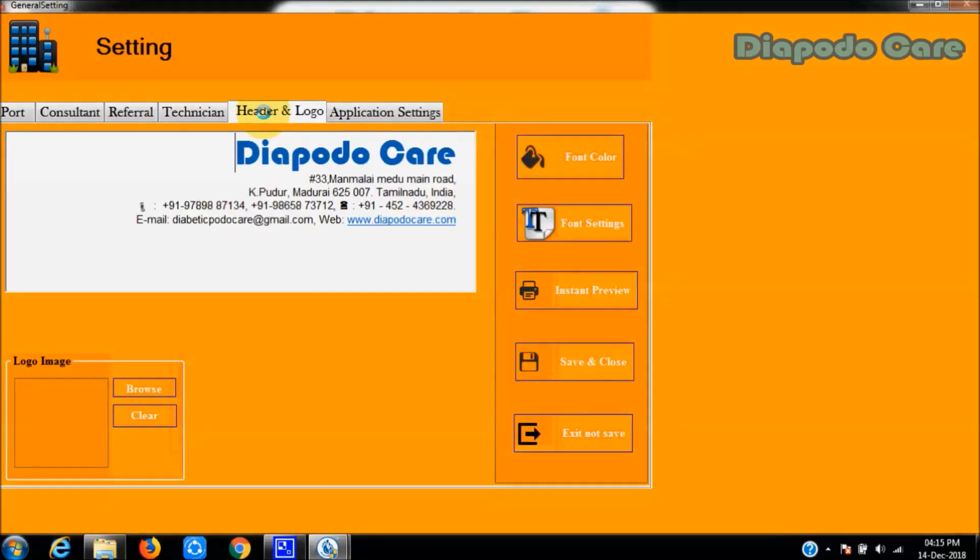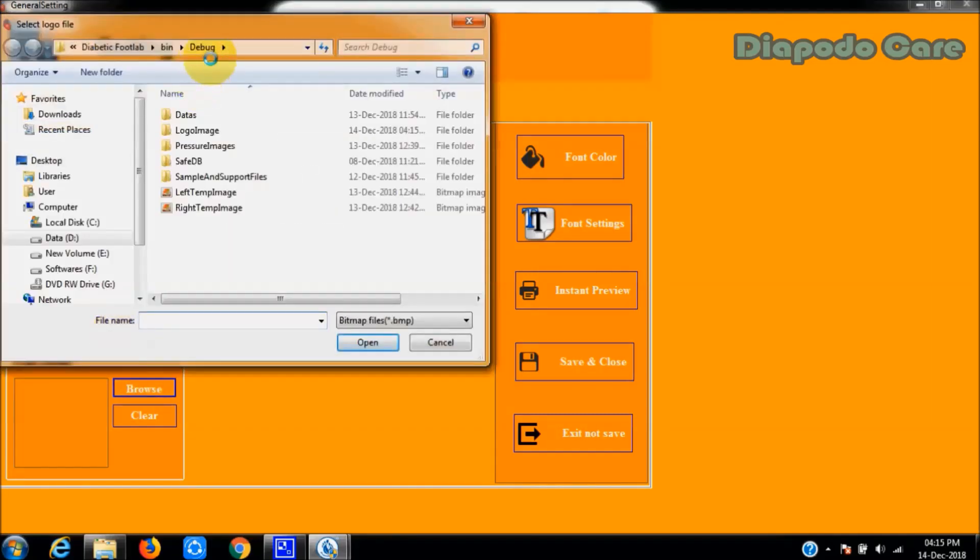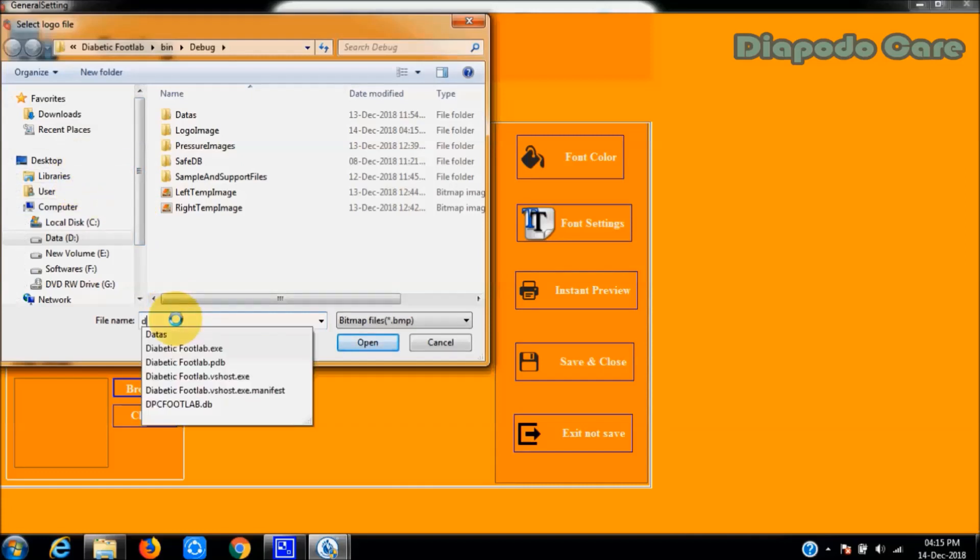Vassabi software also has an option for a customized letterhead and edit option for the patient screening report. Users can select multiple image formats for displaying the hospital logo details in the patient report.